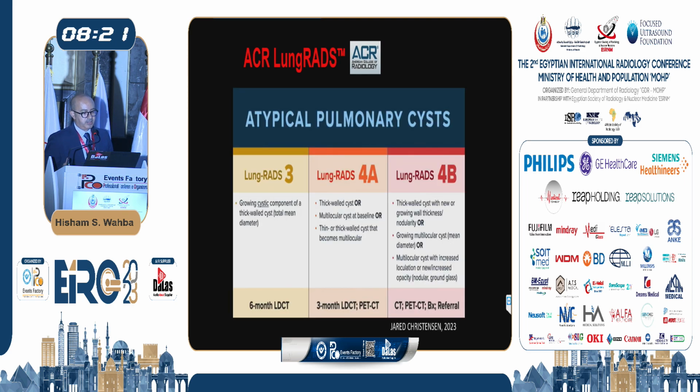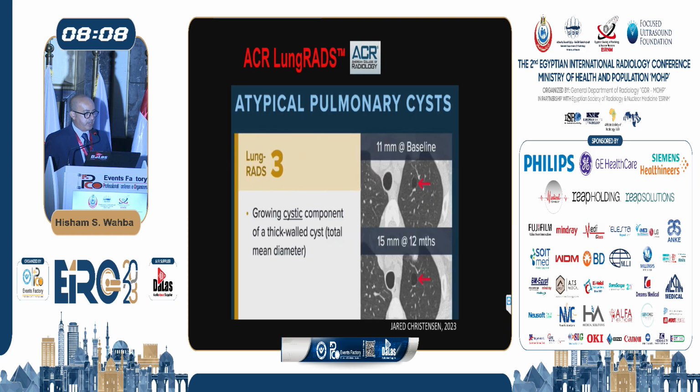And these are the different categories of atypical cysts falling into Lung-RADS 3 with the different follow-up, 6 months low-dose CT, or Lung-RADS 4A or Lung-RADS 4B. And they were incorporated in the new system. And this is, by the way, the version that we're using in Egypt.